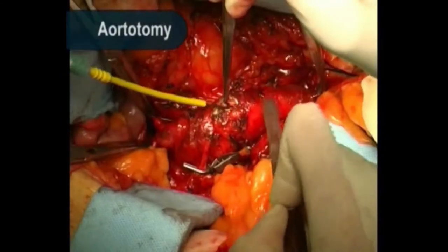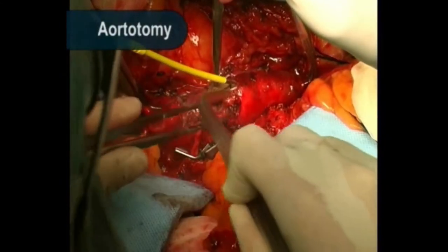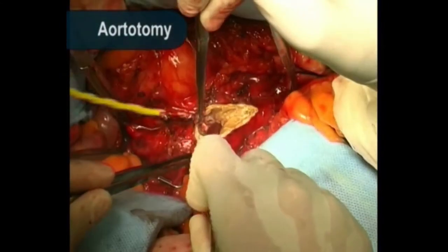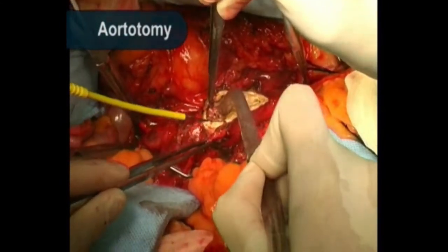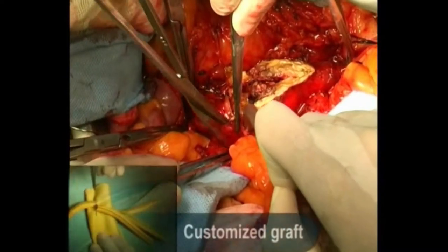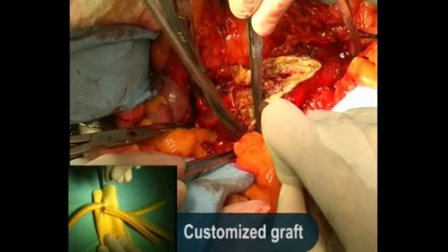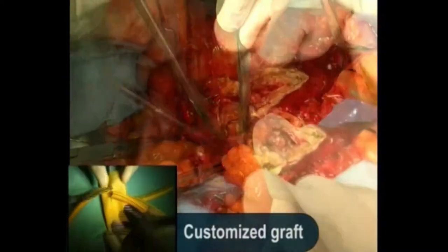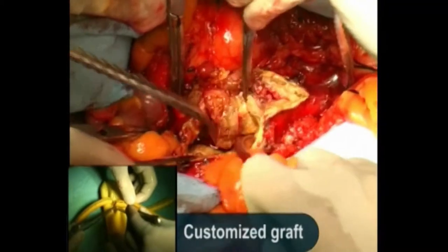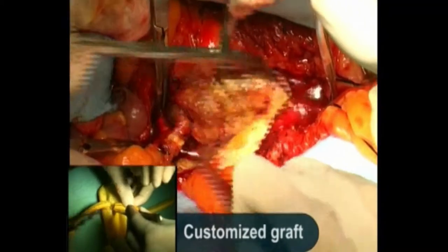The aneurysm sac is opened and parietal thrombosis is removed. A four-branch customized graft is prepared on the bench, tailored to the patient's anatomy.